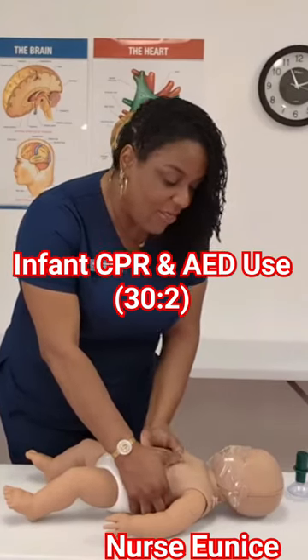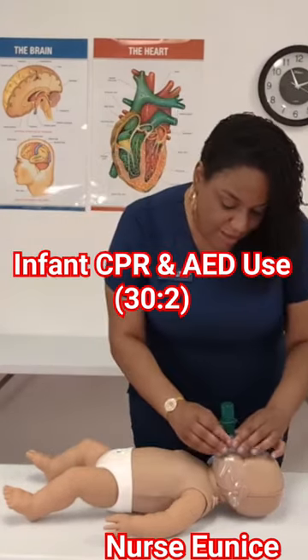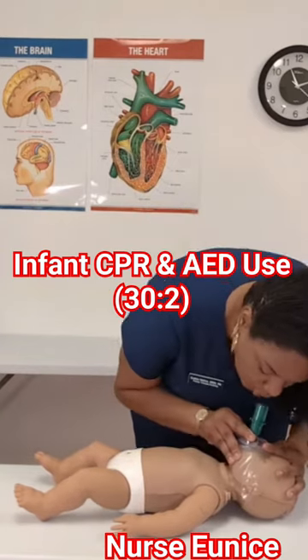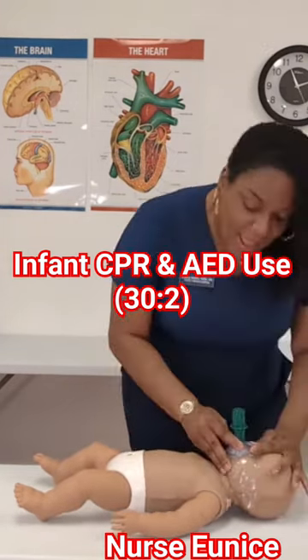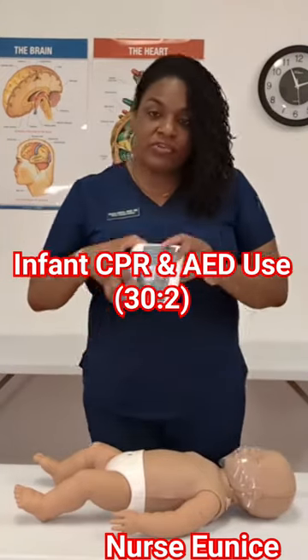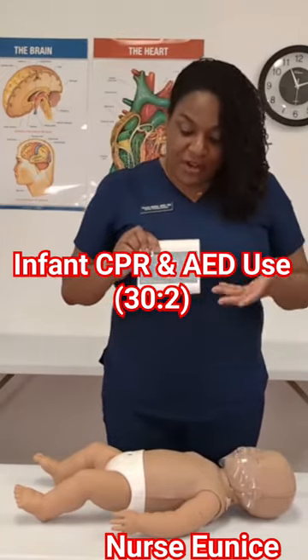Counting 26, 27, 28, 29, 30 — administer those two breaths with a head-tilt chin-lift. I will continue doing this until help arrives, and help has just arrived with the AED.